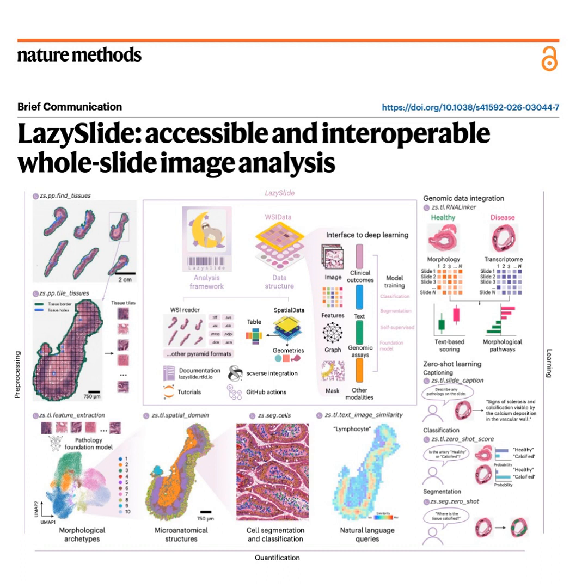Okay, so now we've isolated the tissue. What happens next? Once the tissue is isolated, LazySlide performs tiling. It chops this massive irregular shape into a manageable grid of perfectly uniform image patches, usually 256 by 256 pixels. Like cutting a giant pizza into tiny, perfect little square slices. Exactly. And it checks each tile against that mask we just made, dropping any tiles that are mostly background. Makes sense. Don't waste time analyzing blank glass.